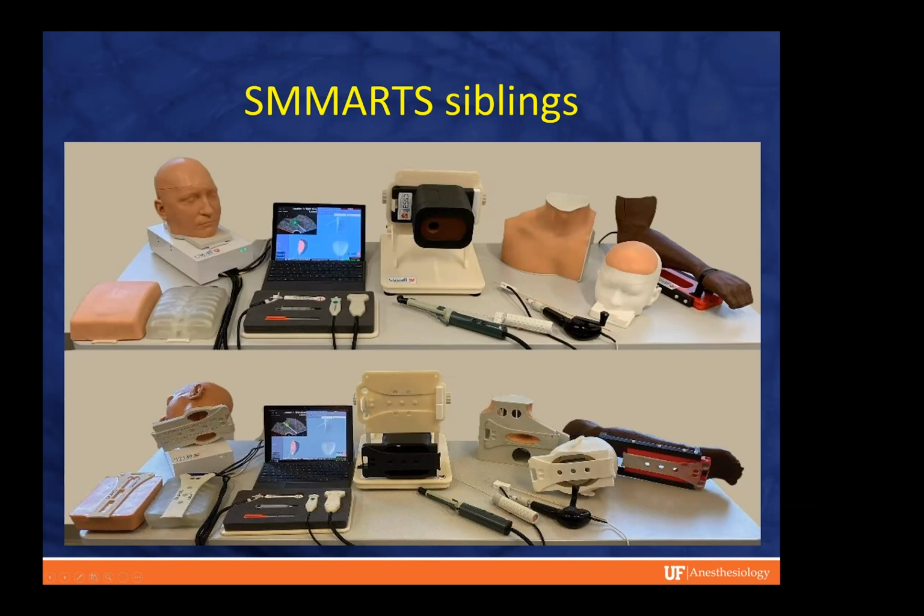So this sort of allows, with this one in particular, people to learn essentially how does 2D ultrasound represent 3D tissue, and how can you use the information from a 2D ultrasound to more reliably sample the vast majority of prostate tissue when you're taking a prostate biopsy, rather than accidentally ending up with a more limited sample.